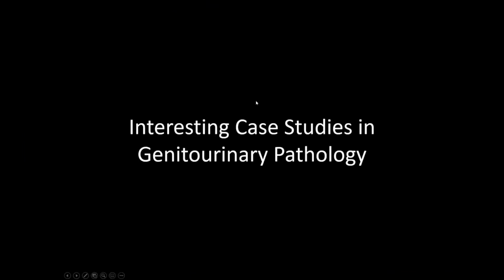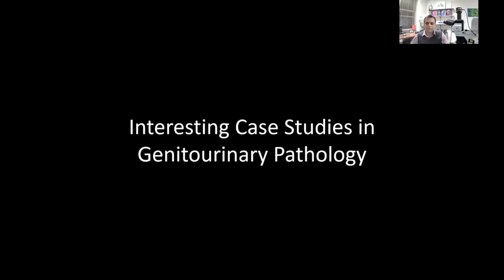I welcome Dr. Paari Murugan to continue the session of a slide discussion. So I have 4 interesting cases that I came across in our practice, and each of these cases belong to one separate organ system. I've selected one case from the bladder, one from the kidney, one from the testis, and one from the prostate. So I found these cases very interesting and thought-provoking. So I wanted to share them with you, and I hope you will feel the same about them.